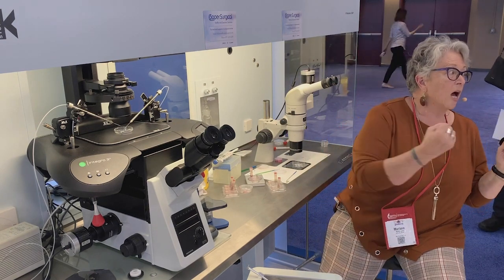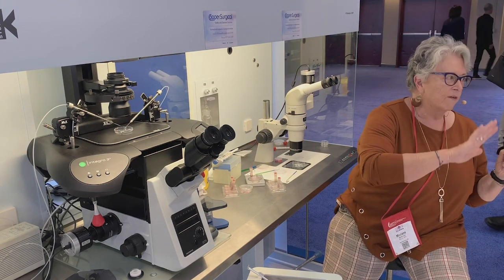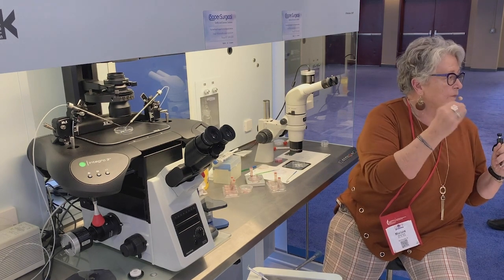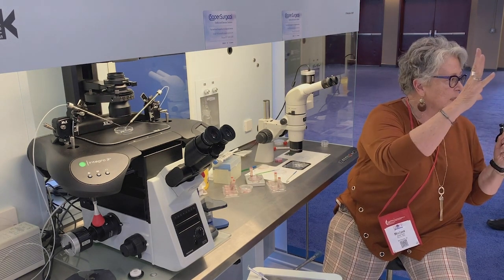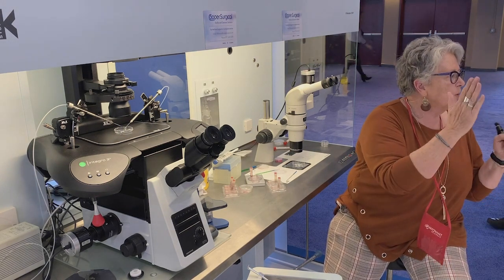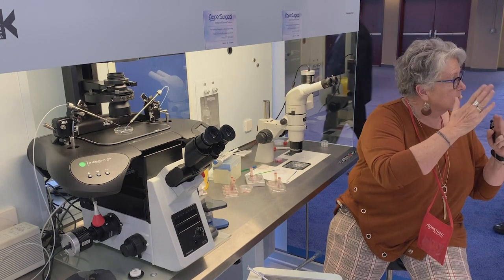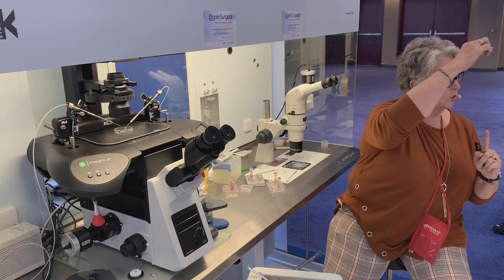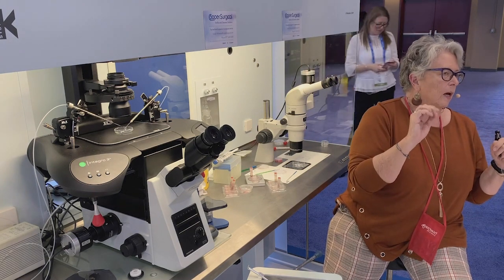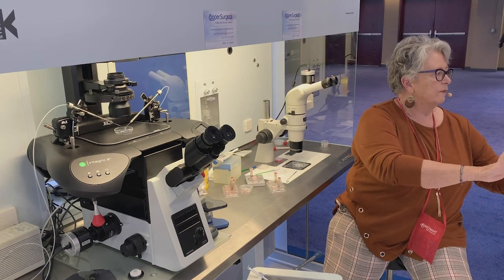Yeah, so again, I'm not tight and I'm not close. All you have to do is have a visualization of this. When you're first doing those studies, if you want to watch the shrinkage and re-expansion of the blastocyst, obviously you have to be tight enough to measure it. So we would put it on an inverted scope, get out our measuring tool, and take measurements both vertical and horizontal. But once you have that figured out, then you want to be relatively far back.